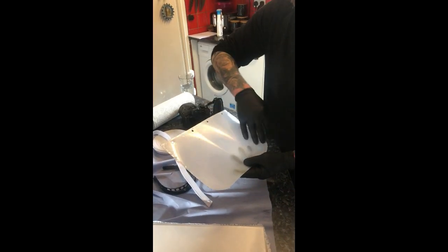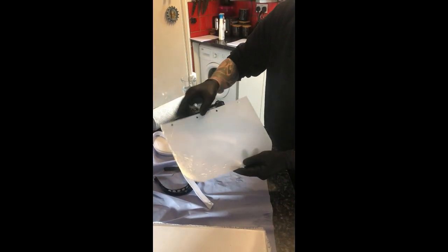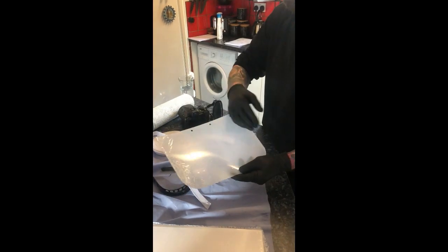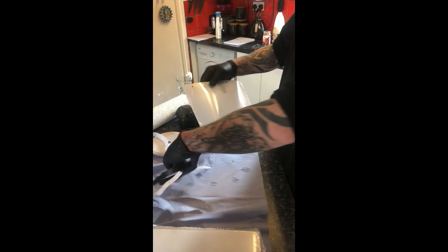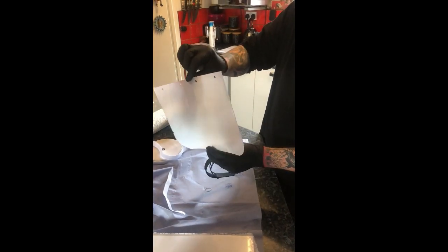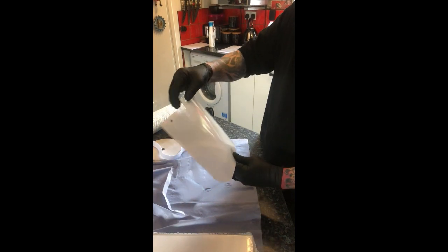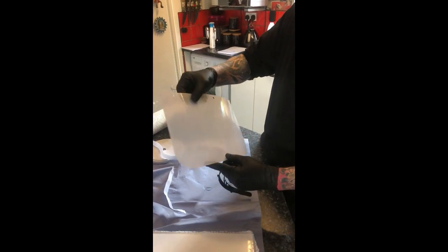The sheet comes with a protective layer on both sides — it's white on the outside and clear on the inside, that just peels off. We're going to supply them sandwiched between A4 pieces of paper with a date on of when they were last touched. I'm touching them with clean gloves on.